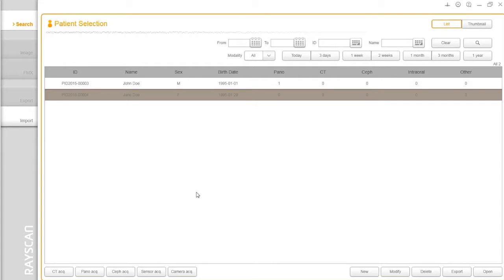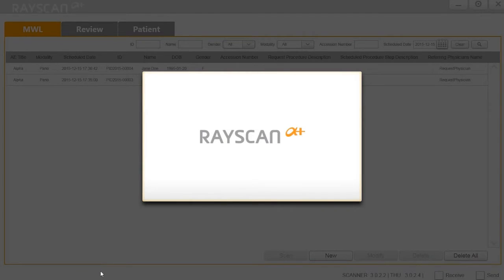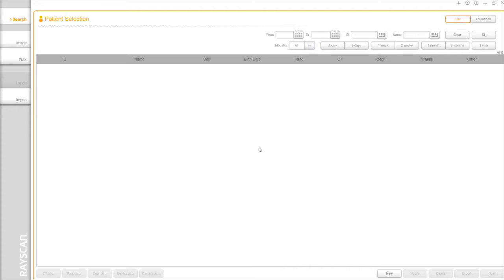On Ray Workstation, you can also launch the acquisition software by one click. Click the modality you need and the new interface will come up as shown. Drop down the modality you need. Let's start with CT.